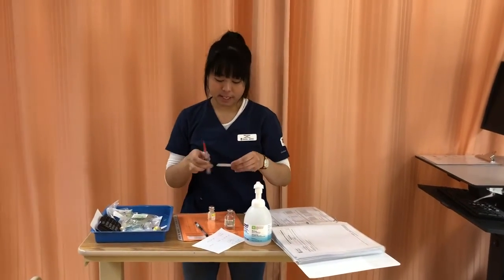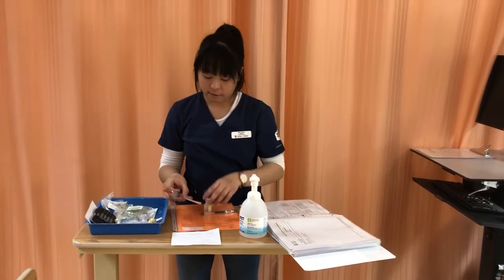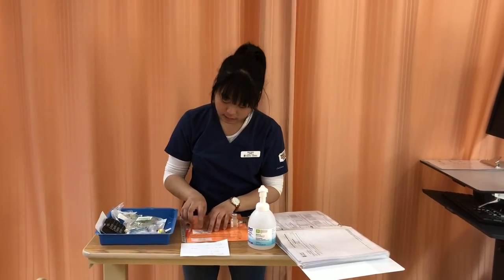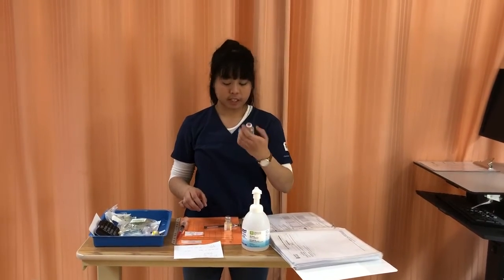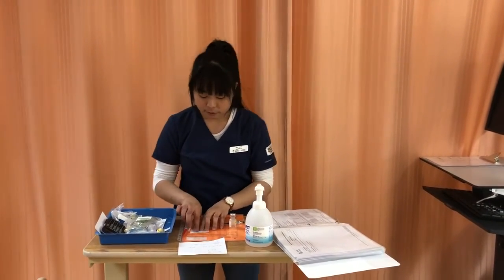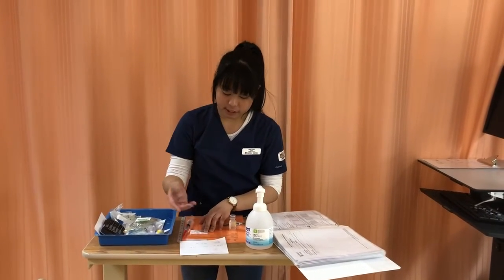So I have here my 6 mLs of medication, and I will do my second check. So I have Frida Fritz, and the medication is Penicillin G, and I have Penicillin G in here, so that's the right medication. I have 3 million units, and it's 3 million units, and I did my calculation right over here.